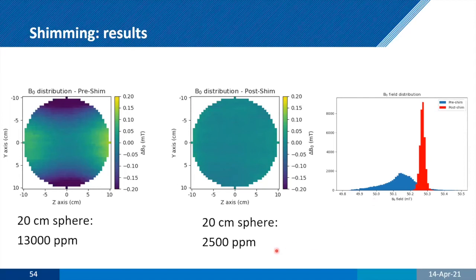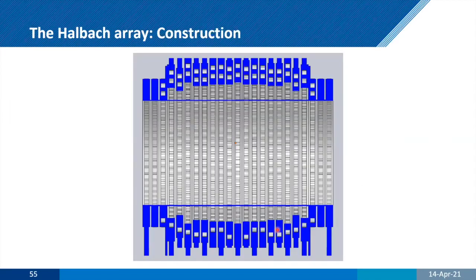Because although 2,500 ppm sounds awful, particularly when you come from NMR, where you're talking about parts per billion, when you transfer this into absolute frequency space, and we think about the value of the gradients there, then we can see that until we go to very, very high resolution, we're not going to be delta B0 limited in terms of that resolution.